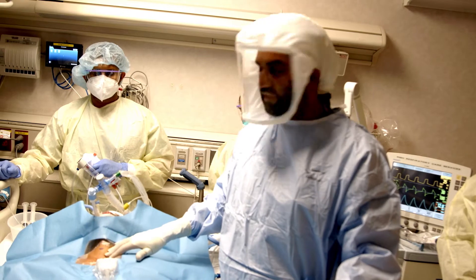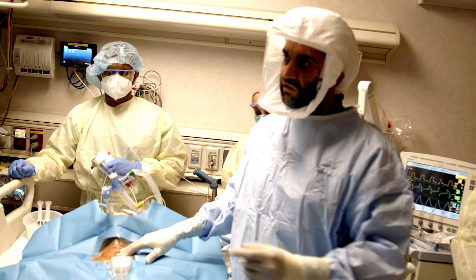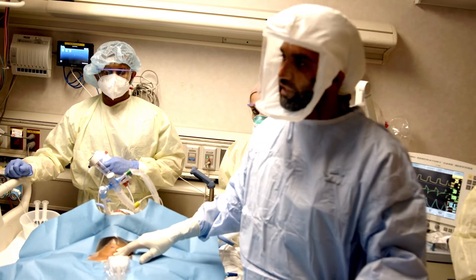On this patient, he's skinny — you can actually feel his anatomy, so this is a good patient to learn on when you're starting. I'll show you the findings on ultrasound to correlate with his physical exam.